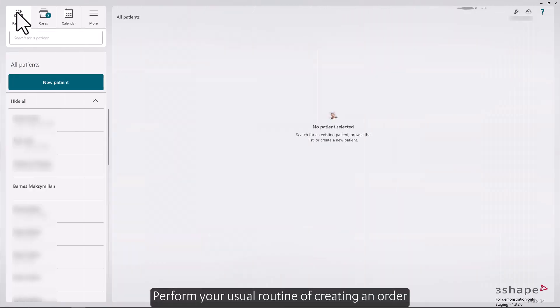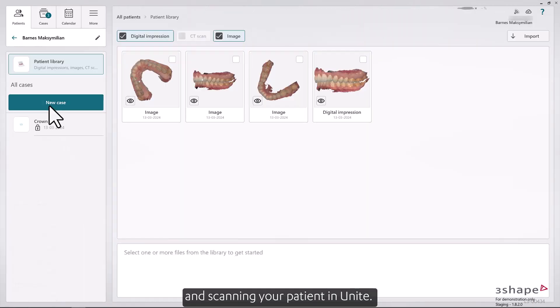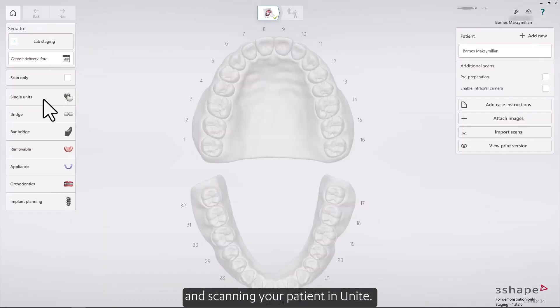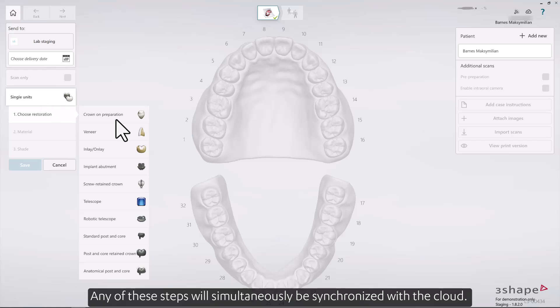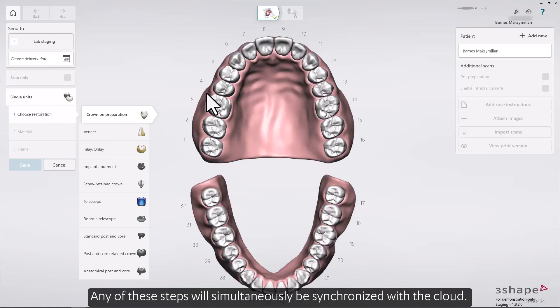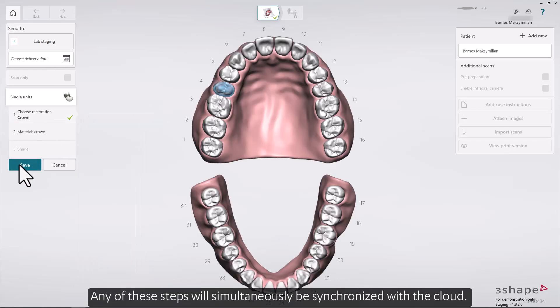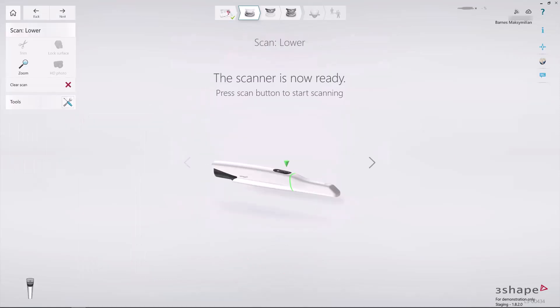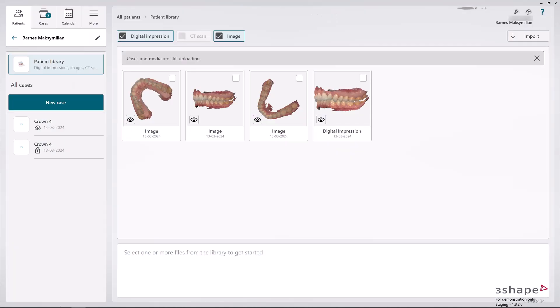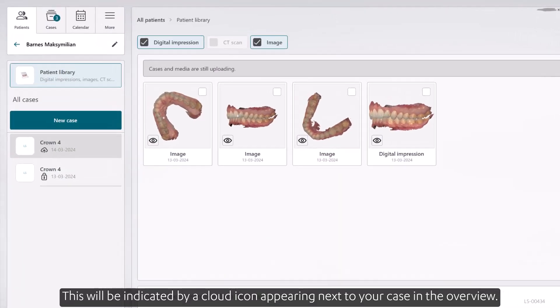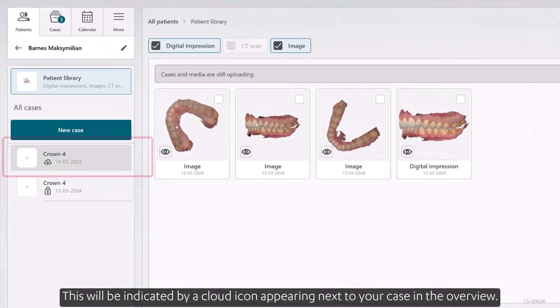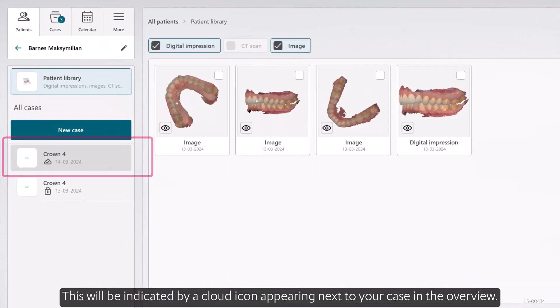Perform your usual routine of creating an order and scanning your patient in Unite. Any of these steps will simultaneously be synchronized with the cloud. This will be indicated by a cloud icon appearing next to your case in the overview.